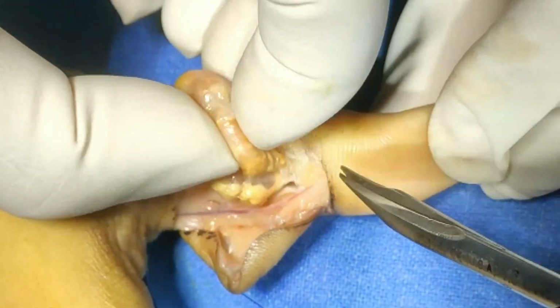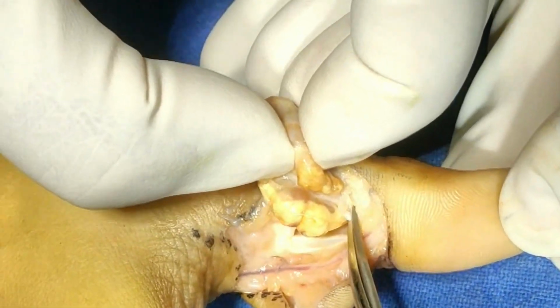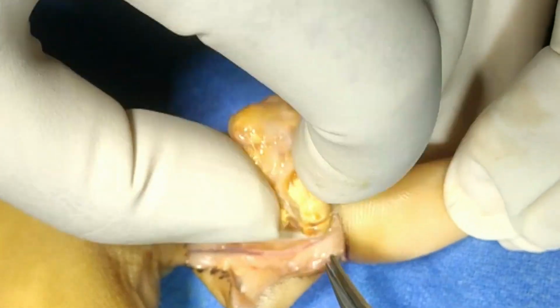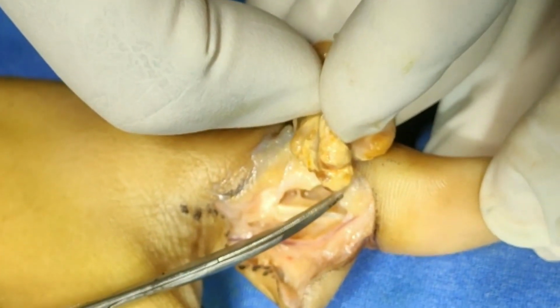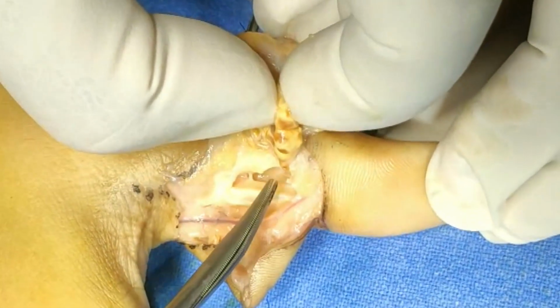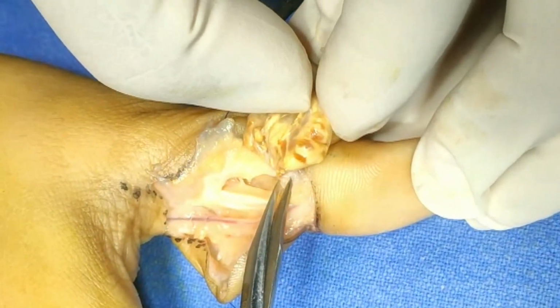So remove everything in toto. These are the neurovascular bundles, so don't get them. See, this is adherent to the capsule also.